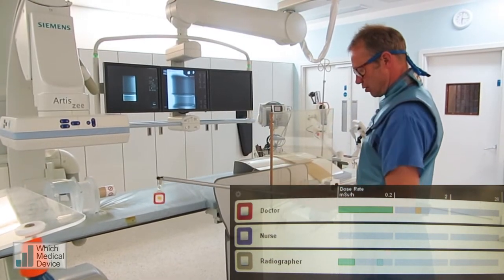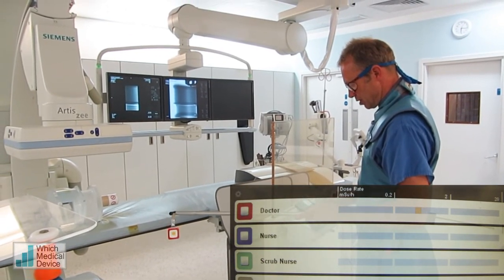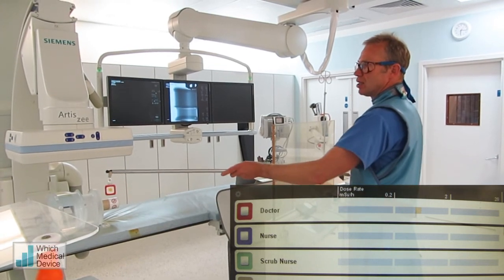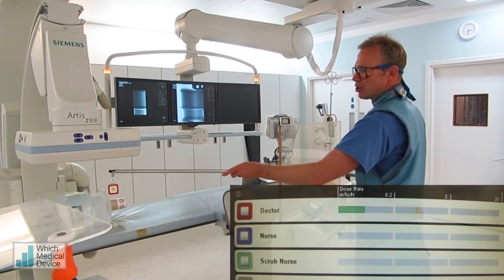The other thing we can do is decrease our pulses per second, so the fluoroscopy could be slowed down. And if we go from 7.5 pulses per second down to 4 pulses a second, of course that's also going to significantly reduce your dose further.